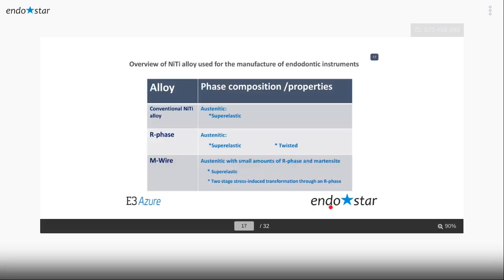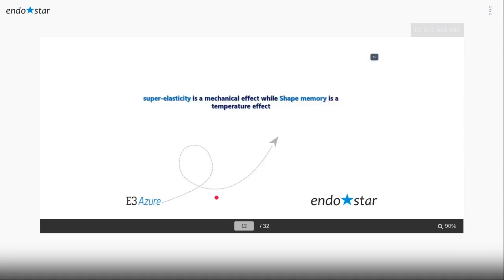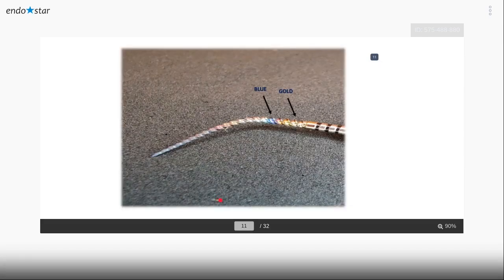Okay. Now, I will try to go a little bit slower so I can speak about some cases. Nickel titanium alloy, as I said before in this picture, if you remember, I want to return to it. Different heat treatment and different nickel to titanium proportion give you different colors and different mechanical properties that impact your work.